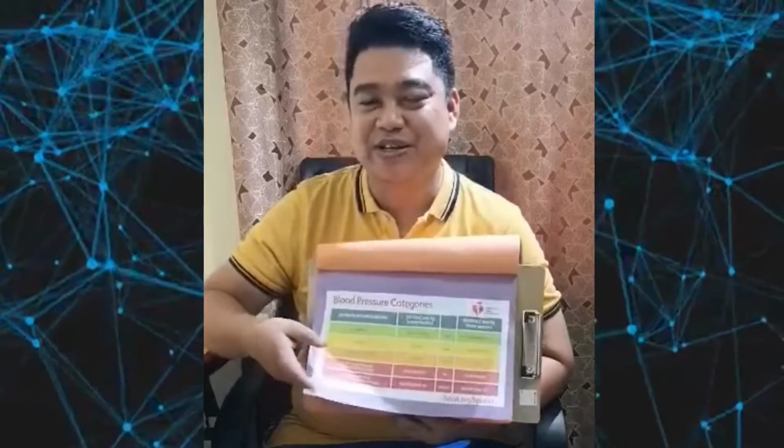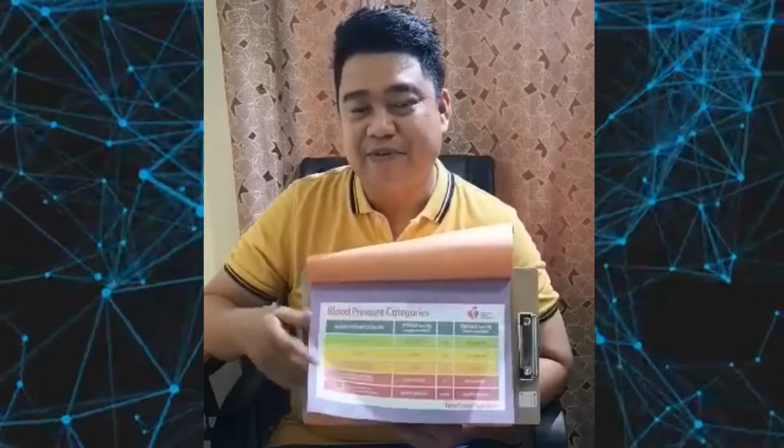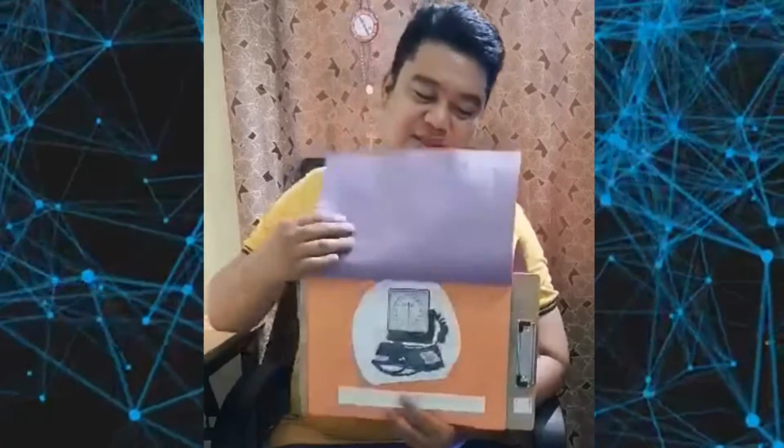None? Okay, that's very good. I hope you are following our discussion. After this discussion, I'm going to demonstrate to you the proper techniques of obtaining a BP. Okay, the next is the device that we use.